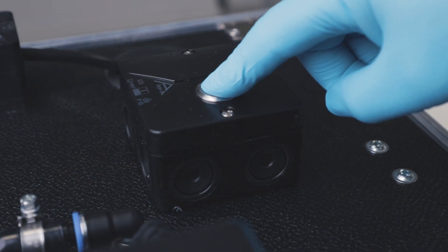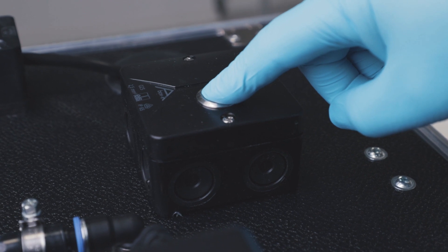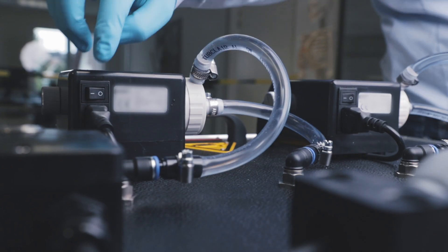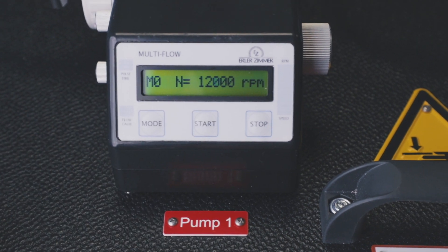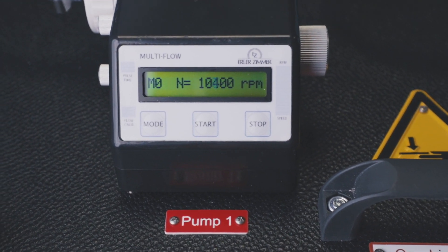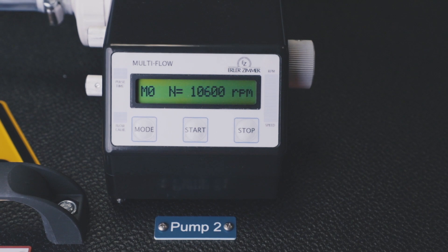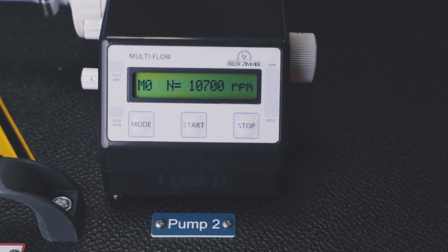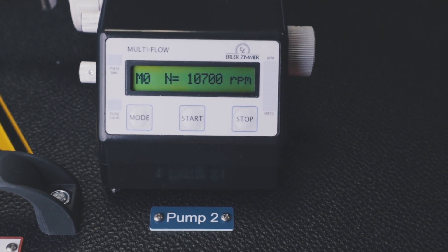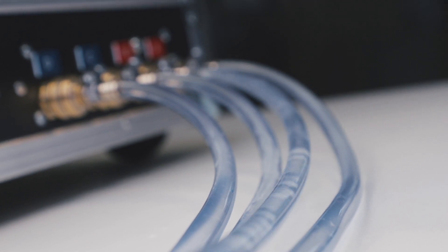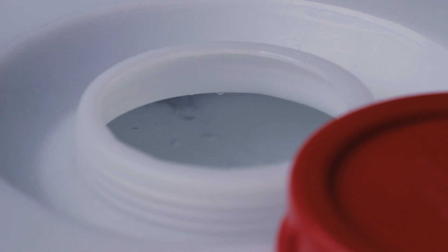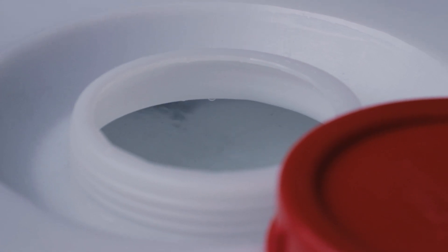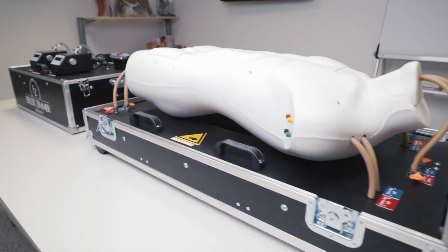Then press the filling button to pump water into the two pumps. Switch on the pumps. Start both pumps in mode zero. The tubes will transport all air inside them to the tank until all air is out of the system. Now, the system is ready to use.